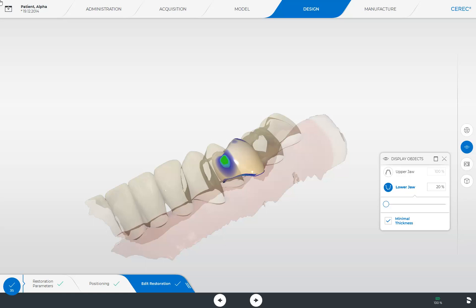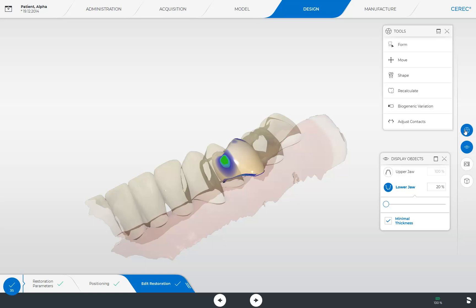For demonstration purposes only, we open our tools in the side panel. With the Adjust Contact tool, we can correct the distal, mesial, as well as occlusal contacts with just one click.